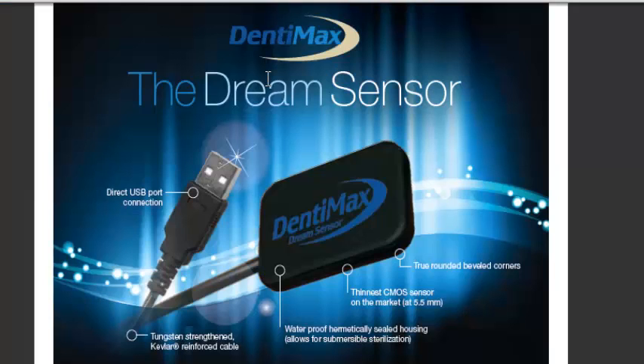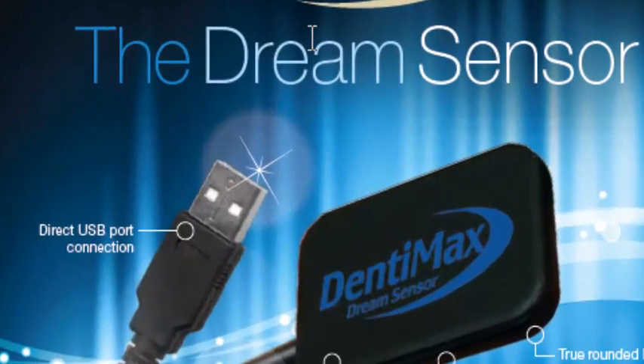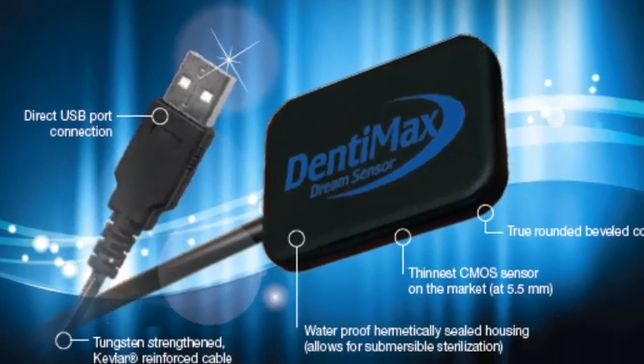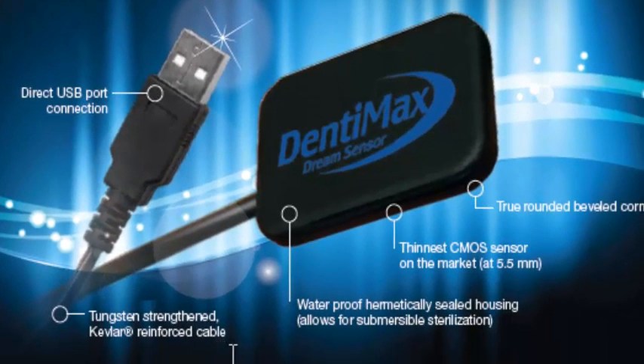Let me show you the Dream Sensor. Our sensor has a direct connection into the USB port on your computer, so there is no box it connects to. It connects directly into the computer — a direct connect, CMOS design. There's a tungsten-strengthened, Kevlar-reinforced cable. If there's an area on a sensor that might break, it would be the cable. Our cable has been reinforced, especially the area that goes into the sensor. Our cable doesn't break, and if it does, it can be repaired.